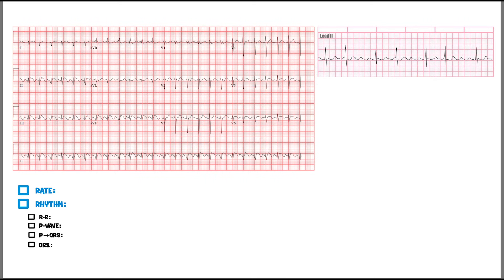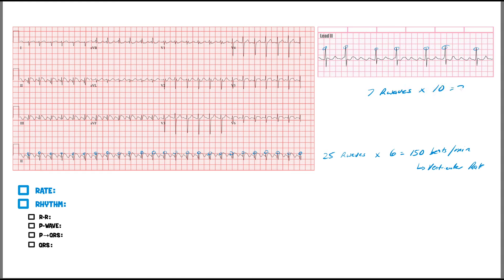Moving on to our next EKG. Let's determine the rate using the 10-second rhythm strip: 1, 2, 3, 4, 5, 6, 7, 8, 9, 10, 11, 12, 13, 14, 15, 16, 17, 19, 20, 21, 22, 23, 24, 25 — about 25 R waves. Multiply by 6, that's about 150 beats per minute. That's the ventricular rate. On another 6-second strip: 7 R waves times 10 gives 70 beats per minute.